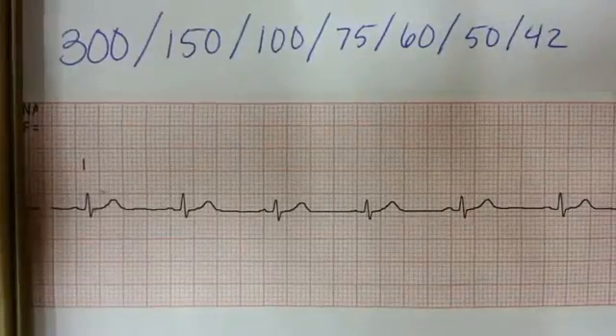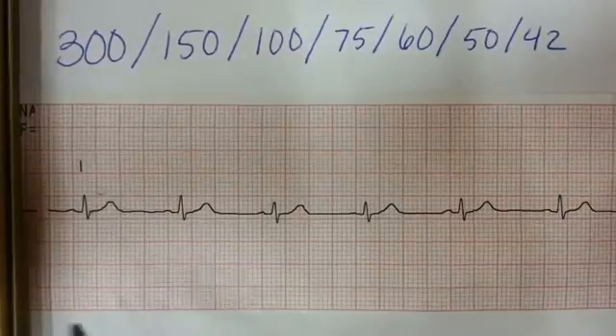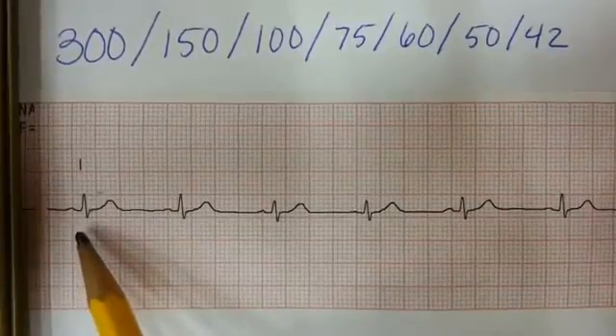In this video we'll go over a quick way to determine the heart rate — this is just one of very many ways. To begin, I'm going to take a look at where the QRS complex falls.